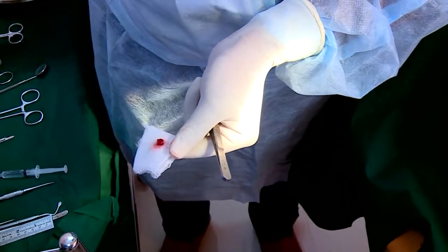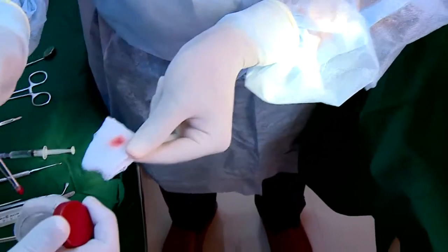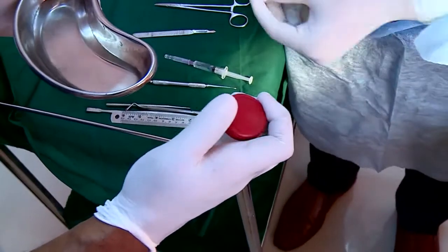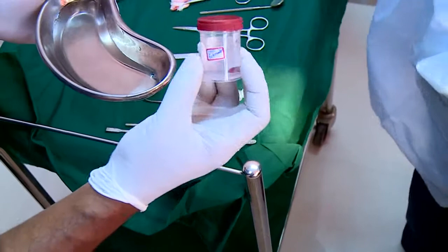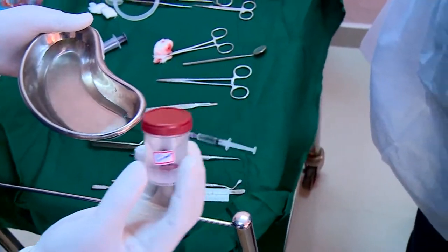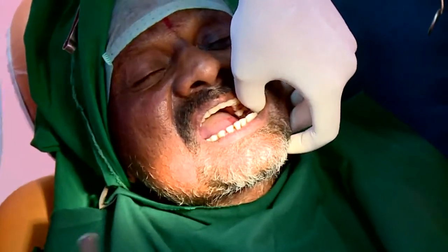Which is very important because you cannot give varying depths to the oral pathologist because they may not be able to assess the characteristics everywhere thoroughly then. So it's being transferred into 10% formalin. That is the normal fixative that we use in clinics. This is 10% neutral buffered formalin. We prepare that from 40% formaldehyde, 1 part to 9 parts of distilled water. So that's a common fixative we use.